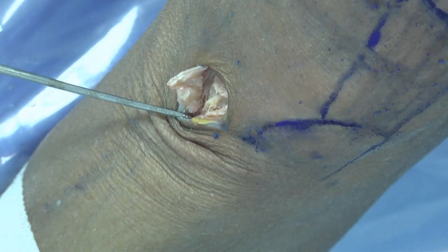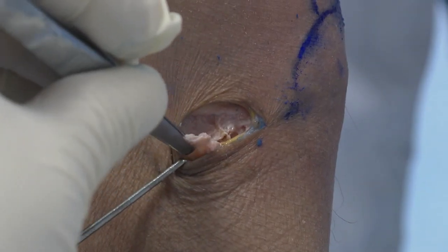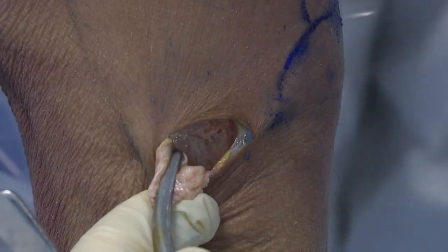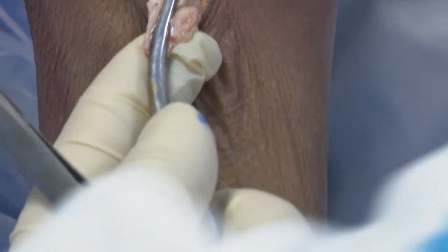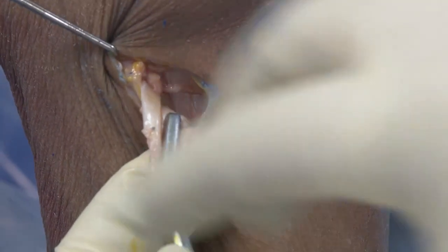So in this area, there's no nerve. You go lower yourself because the nerve is here. Okay. 神经呢是。And after you make this L shape, okay, we go this way and this way, right? Okay, this L shape, then you hold this flap. Okay, you open like this. Yes. Okay. Now you can see underneath, under the fascia. So it's easier. 给它拉近一点。掀开之后就能看到肌腱的止点。再拉近一点吗？Okay. So now you can see very well, right? You see the tendons like that. But actually, you see, this is the gracilis.